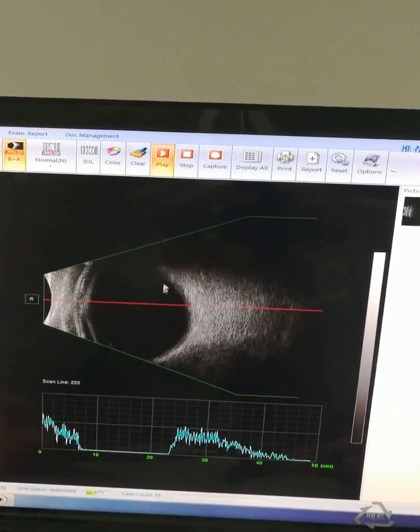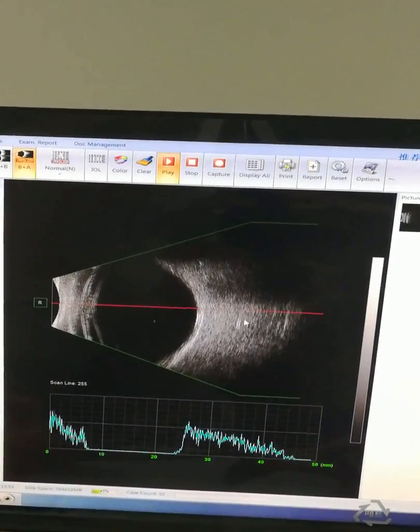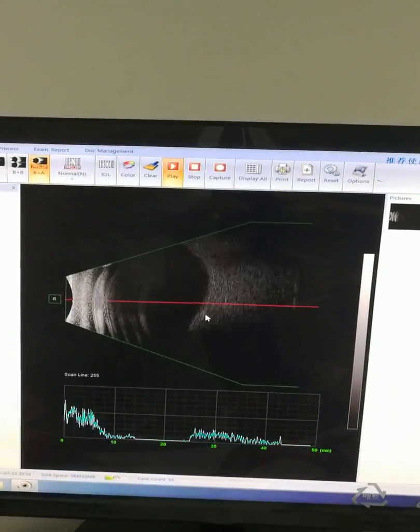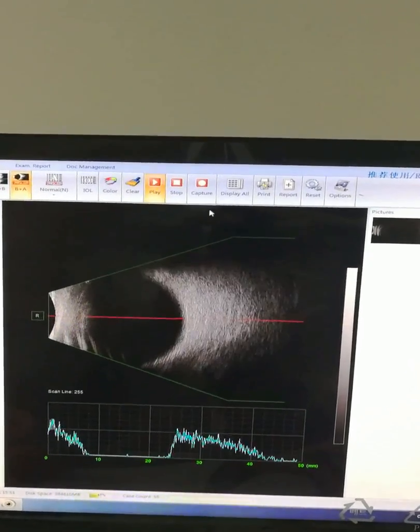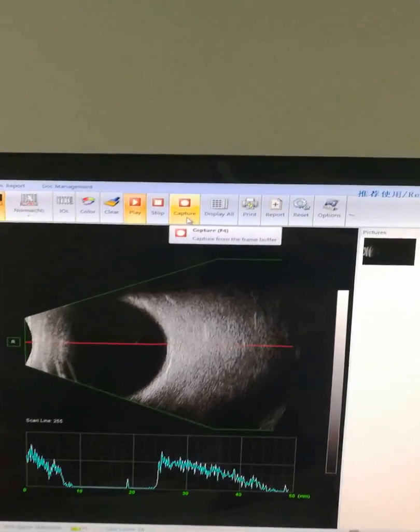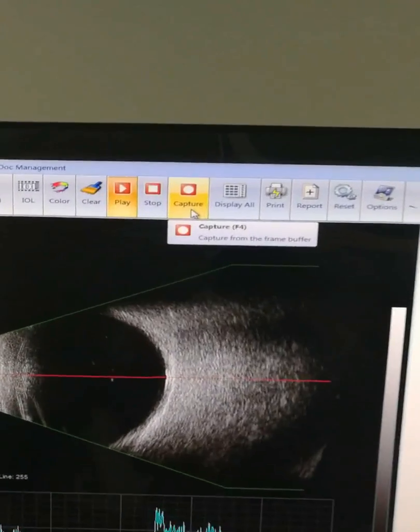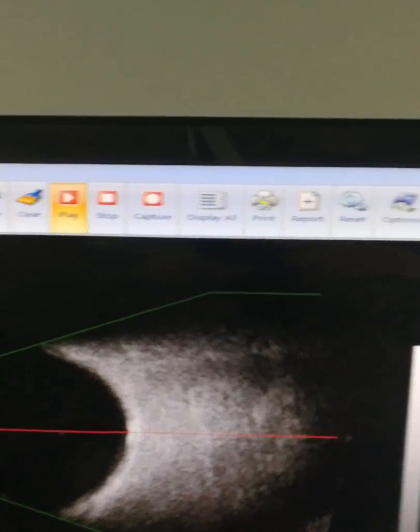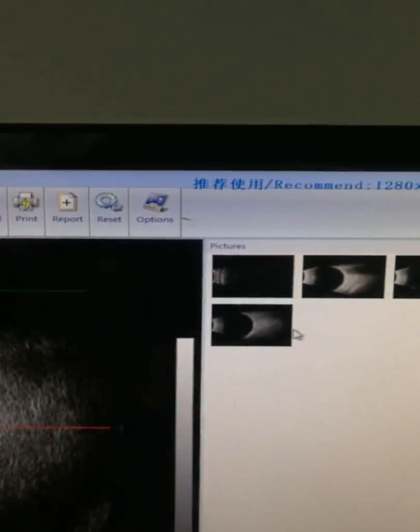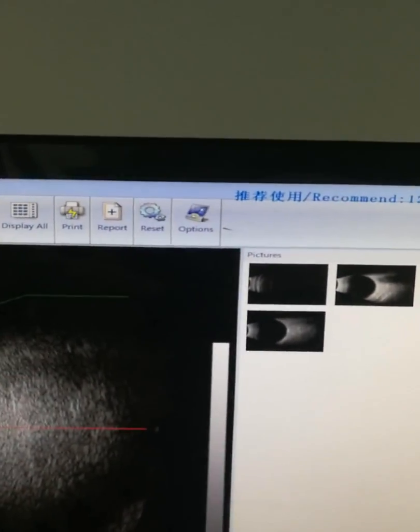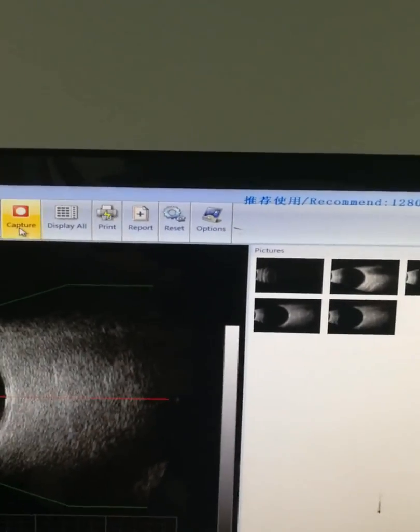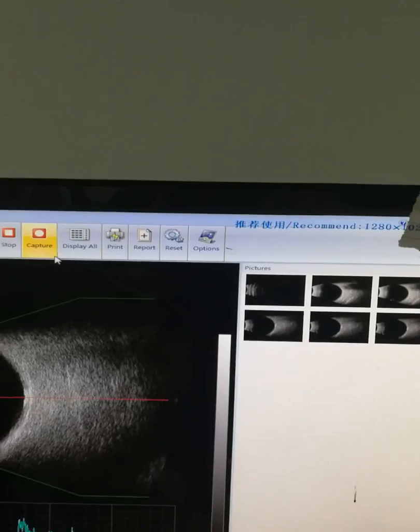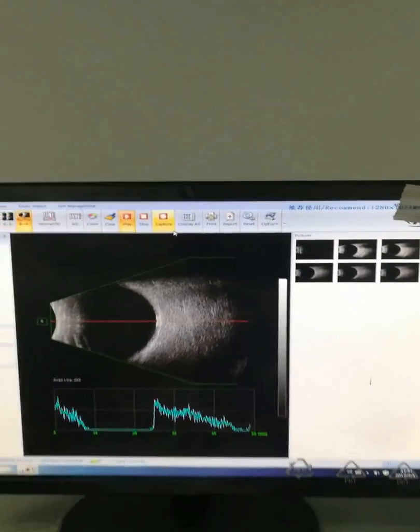This is playback of the captured images. If you think it's okay, click to capture the image here. You can capture the image. It's okay.